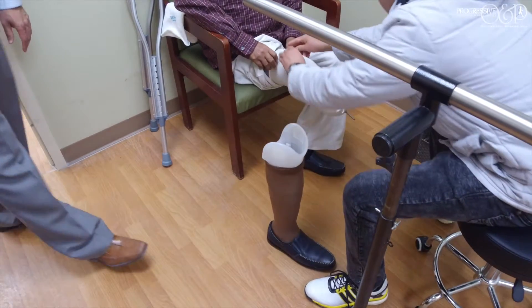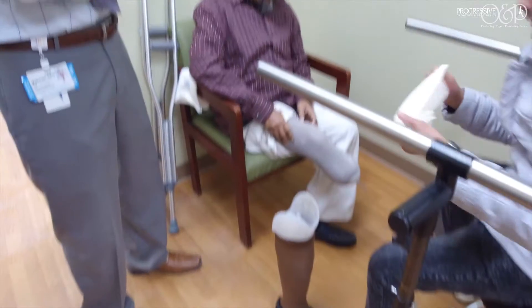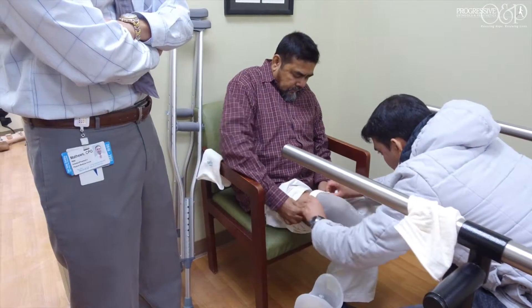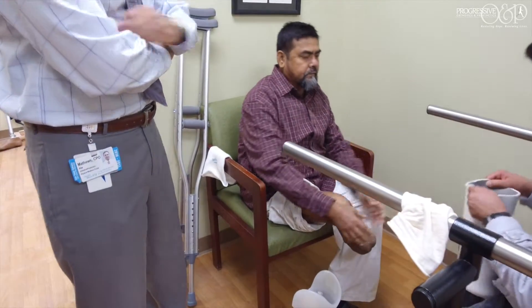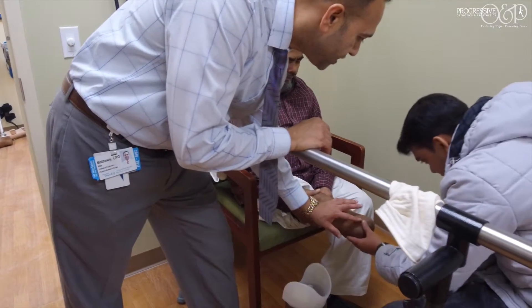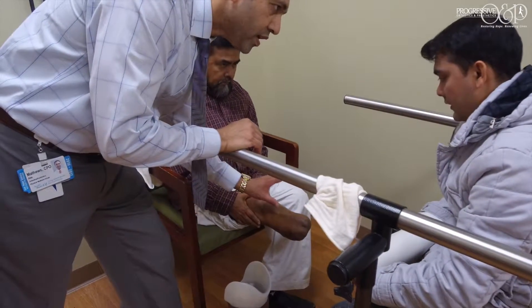Let's check the skin. So when we do that, we want to check for excessive redness. See, there's a little bit of redness? That's okay. A little bit of redness is okay. If anything, it stays red.